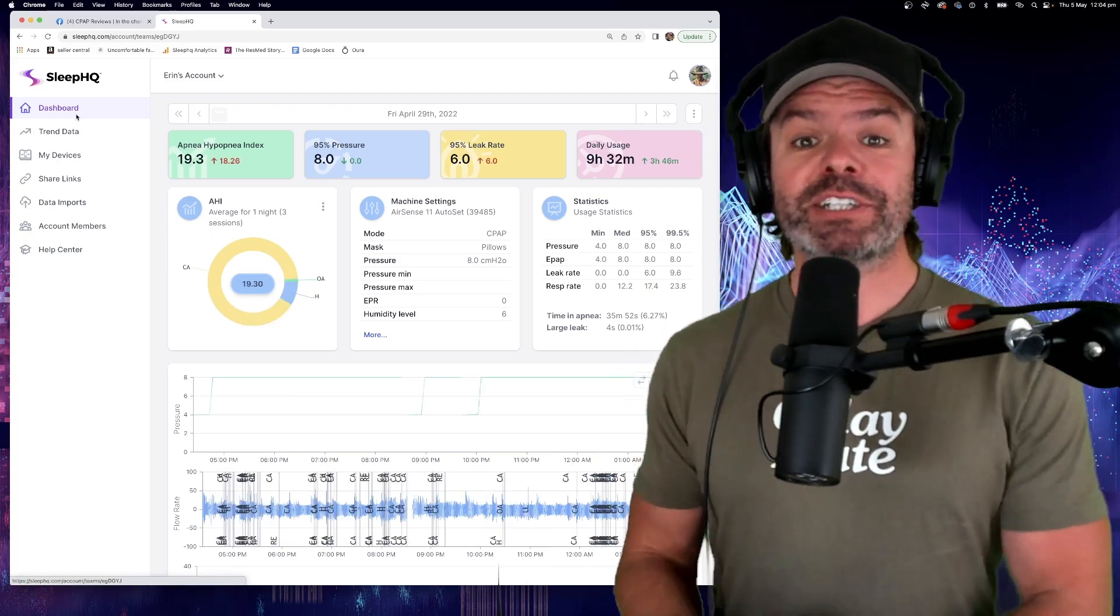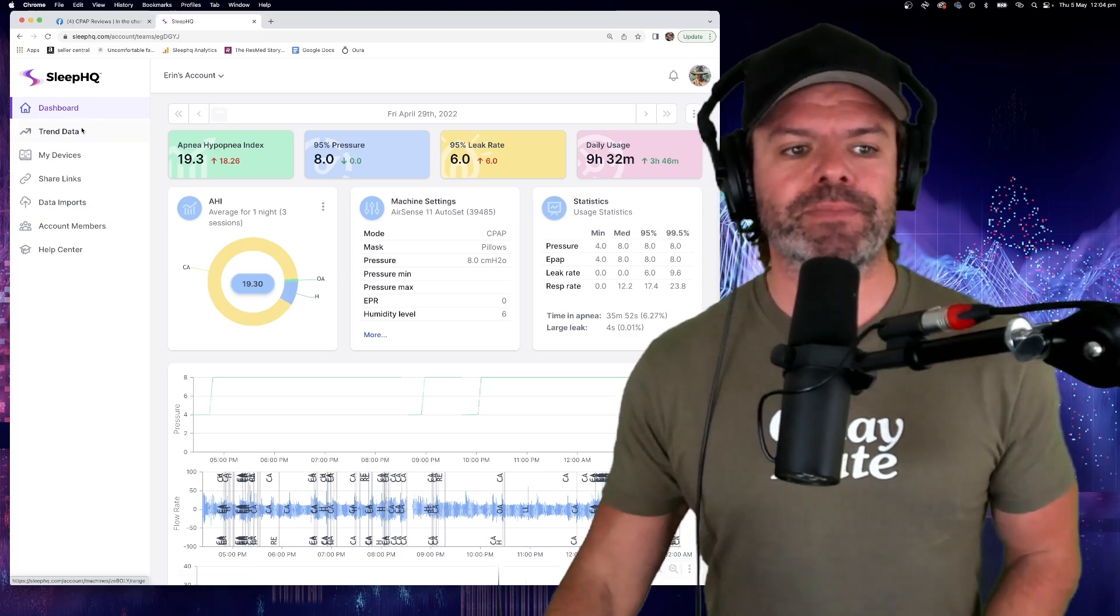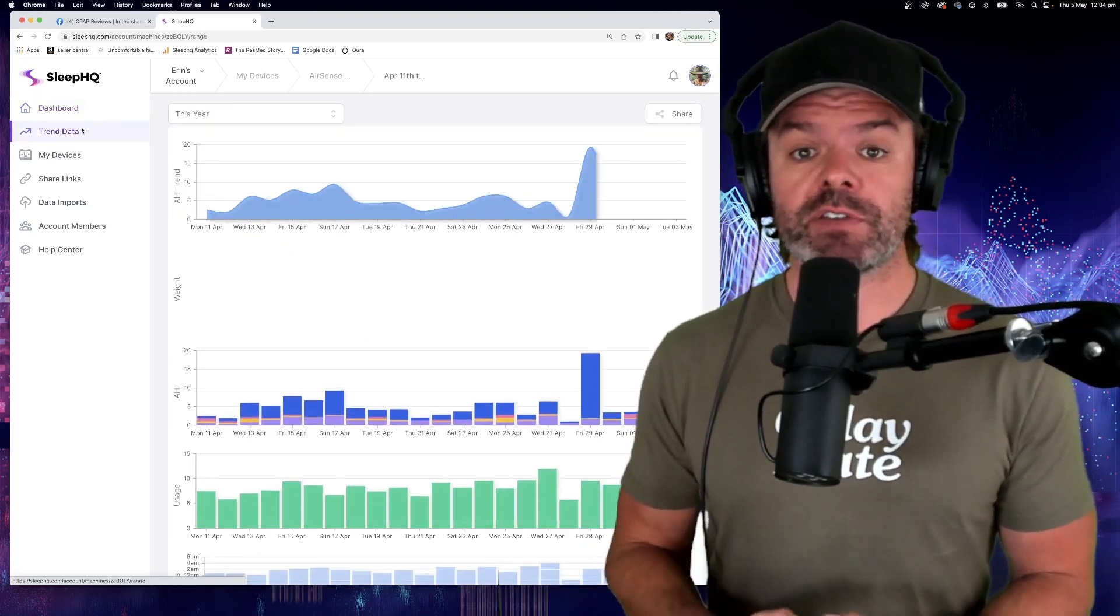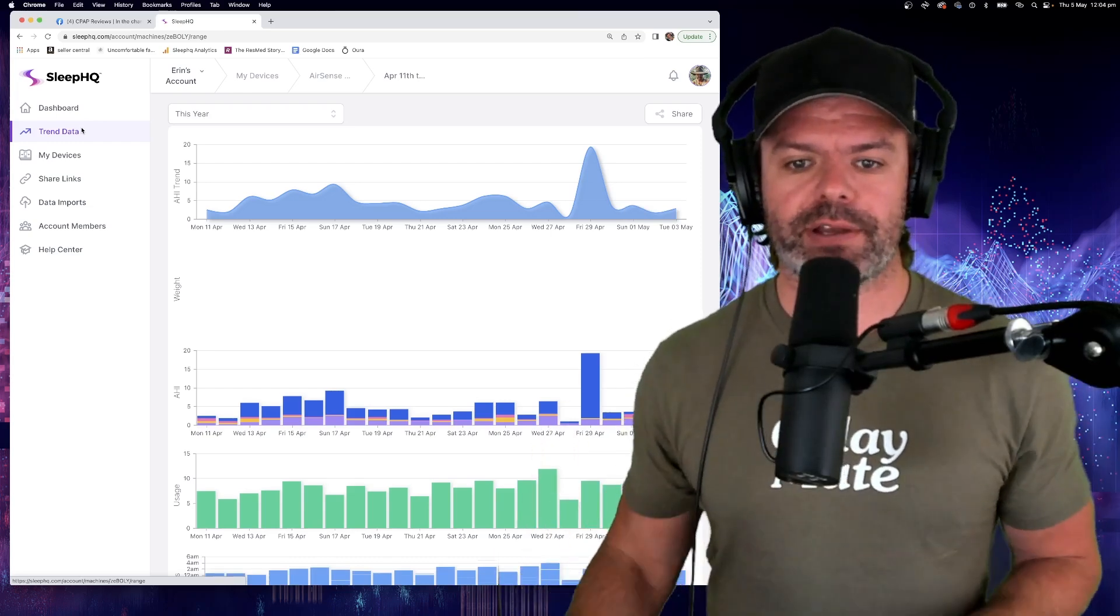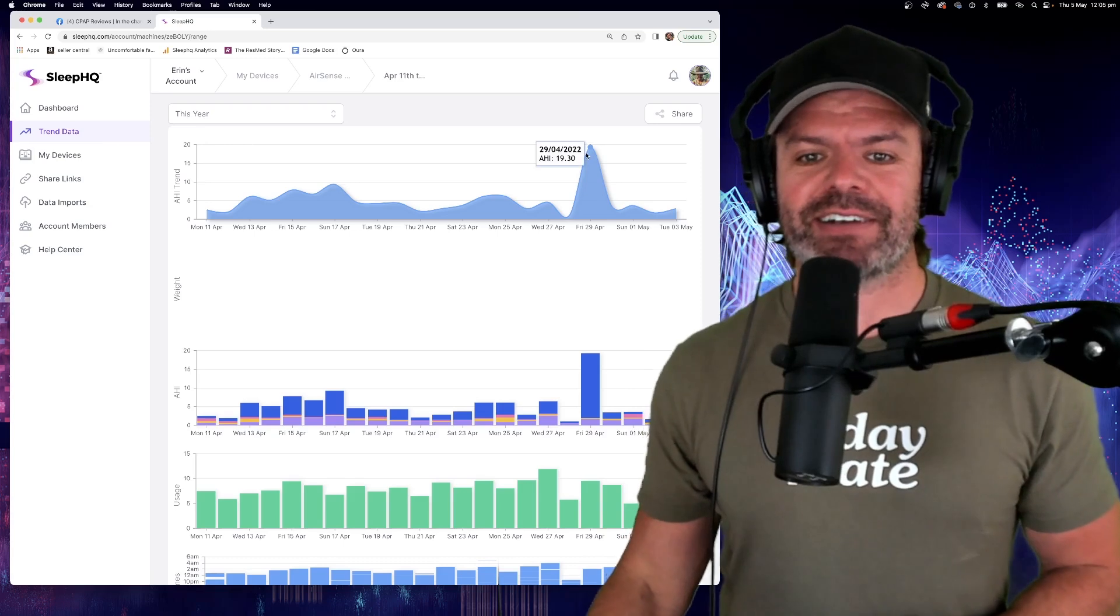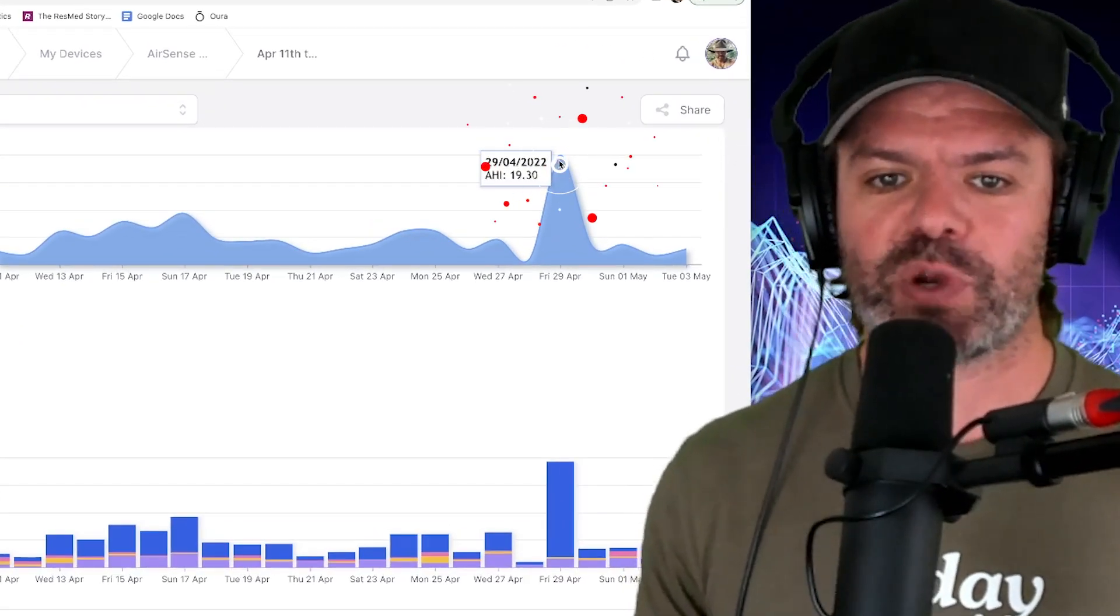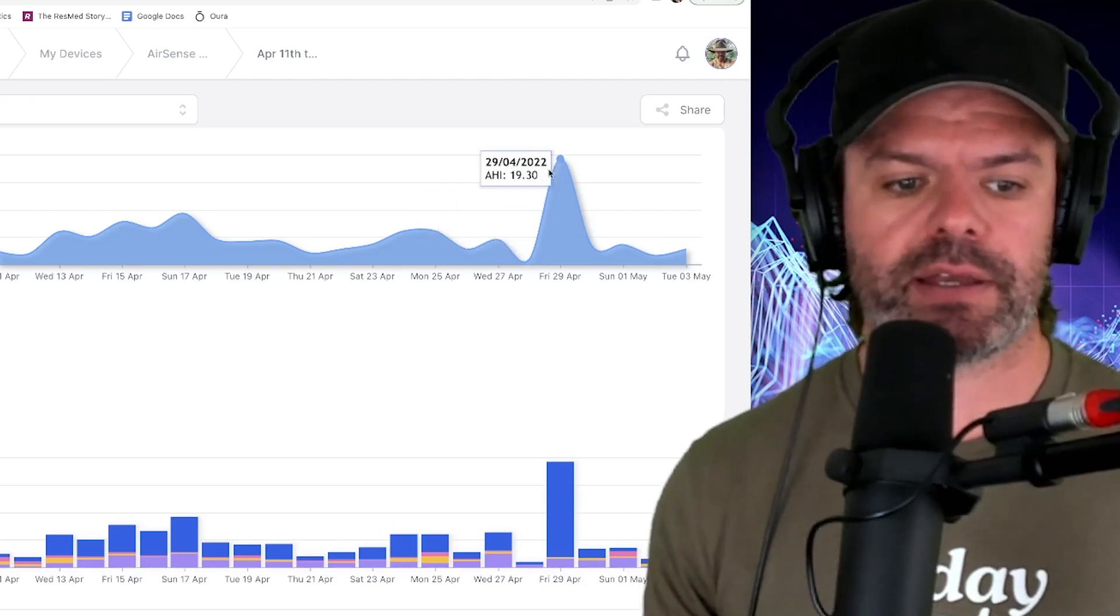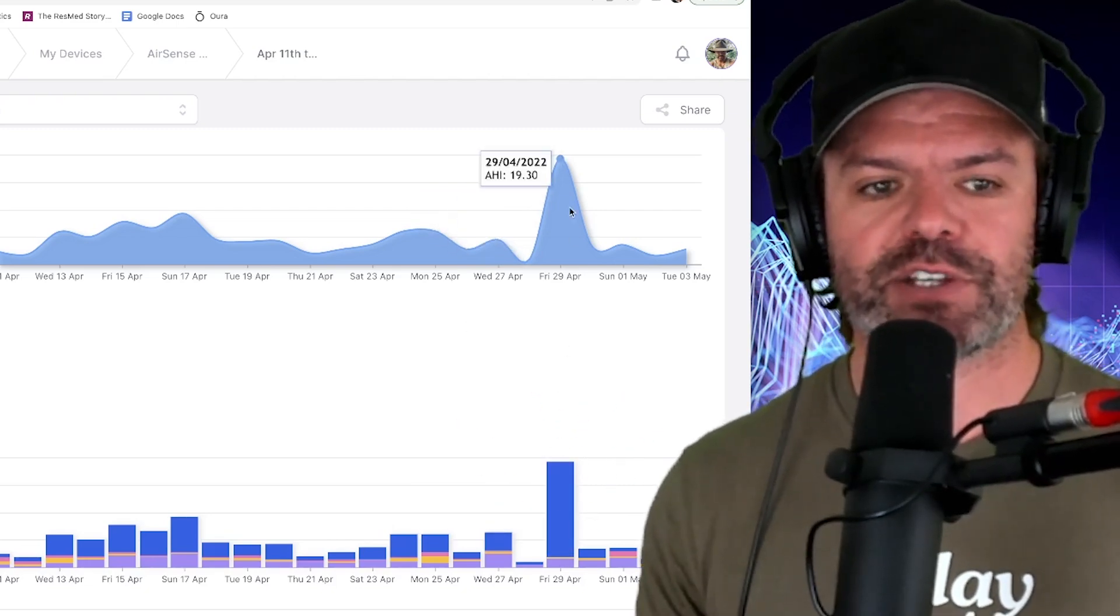Now I'll quickly show you what these results look like in the trend view. Now the trend view is useful because it gives you more of an overview of your therapy. And straight away, you can see right here where the anomaly lies. 29th of the 4th, right? You can see this massive spike and you can see it here as well. All right, so that's the trend view.